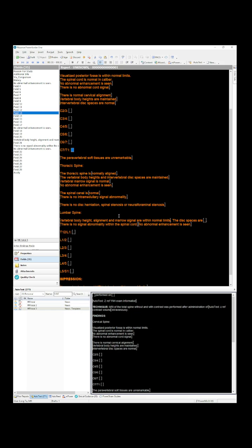So especially in patients who have fairly extensive and complex pathology, where the real focus is on the metastatic disease, we're really looking for actionable things. We're talking about worsening metastatic disease, pathologic fractures, new epidural extent of disease.